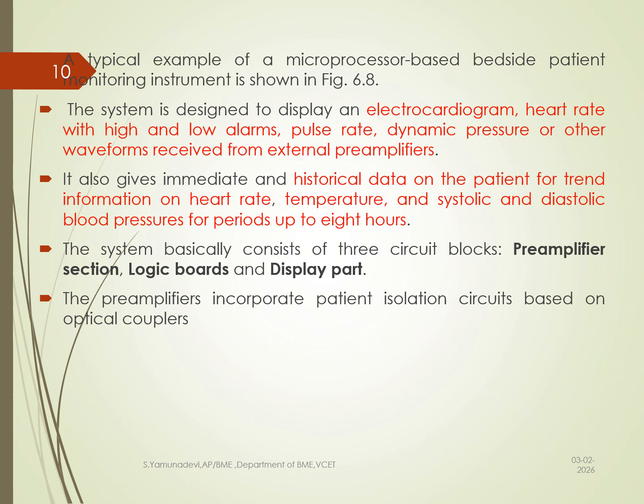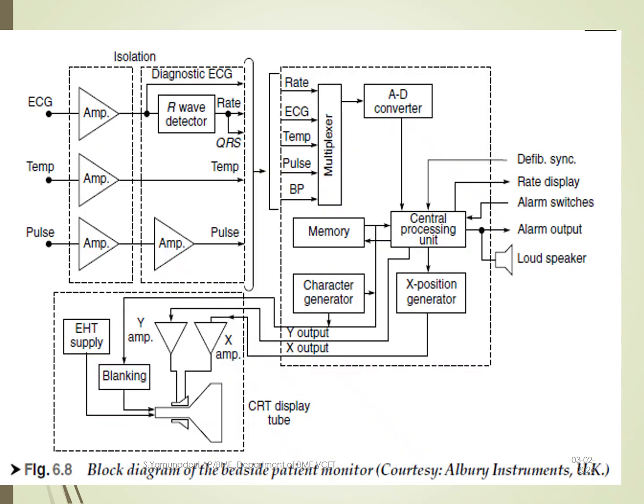In this, preamplifiers are used to provide a better CMRR compared to other amplifiers. It is mostly used for the low frequency signal analysis section.